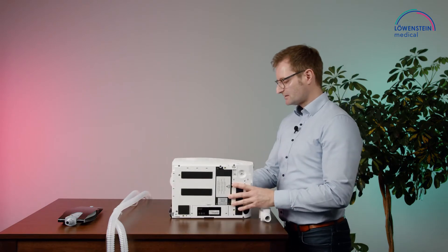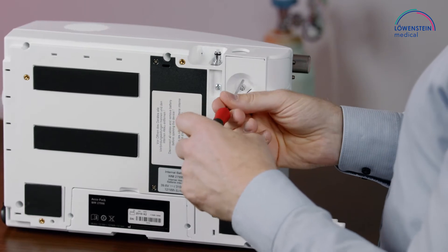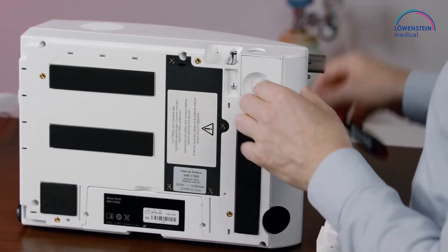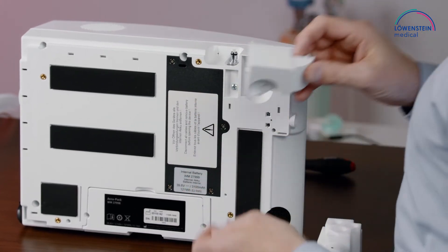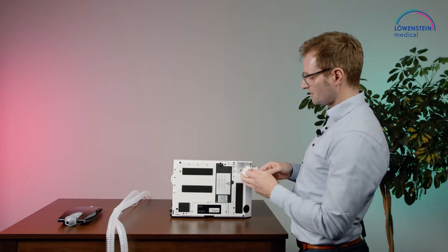We need to put the device on its side, take off the screw, remove the cover, and insert the exhalation module.